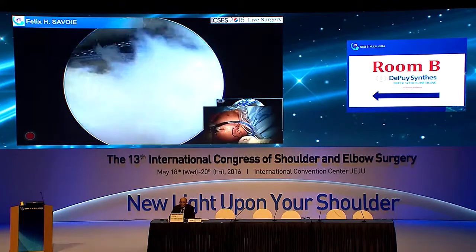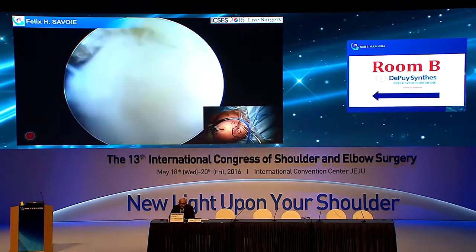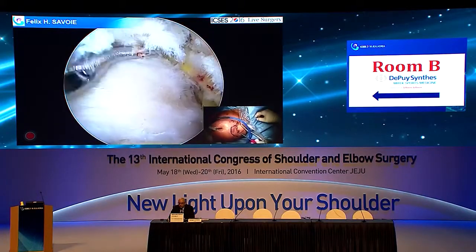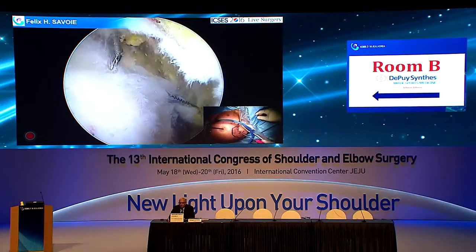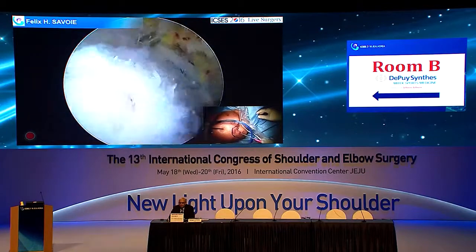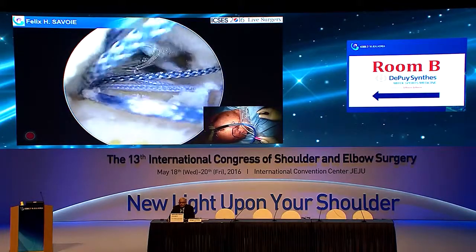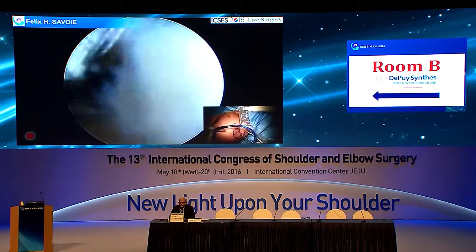Thank you. I noticed, Buddy, that you put that medial anchor slightly more anterior, and I know that was by design, but can you explain that for me? Sure, it's an L-shaped tear. I want to move the whole thing over to the front. So tears pull medial and posterior. I want to make sure that when I do this, I change that vector. I want to pull this upper infraspinatus back up.